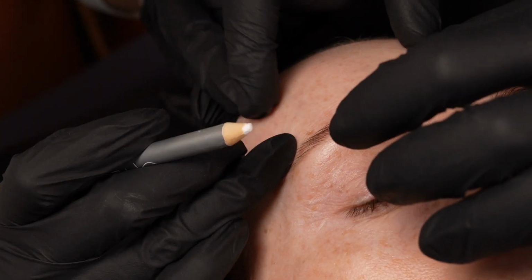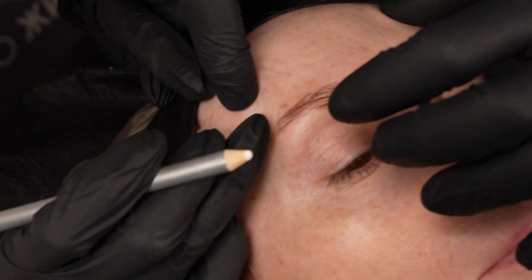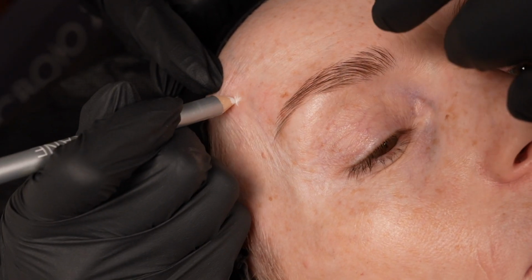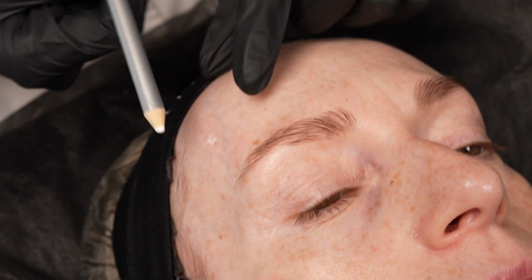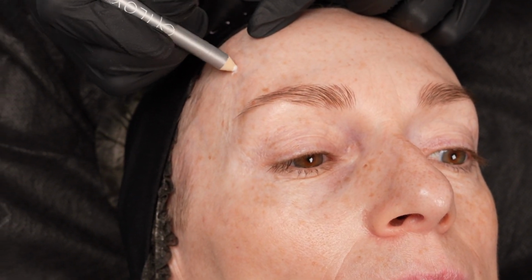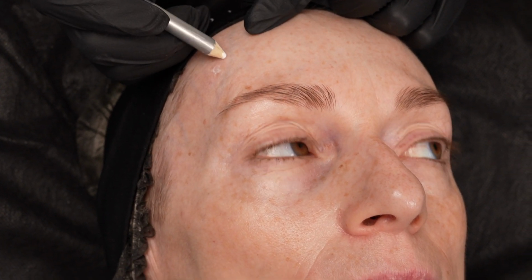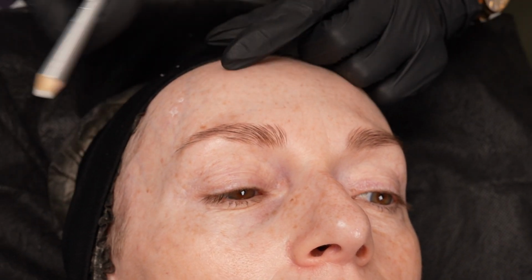Здесь прям видно венки, да, я вот примерно... Feel the crest here. Там есть гребень у нас. Exactly. Он рекомендует be careful с гребнем. She has a thin skin and a light skin color. You can easily see the veins. Can you see it there also? Да, примерно вот в этой зоне я делала прокол. What happened if I touch the vein? Not the big problems. The hematoma, yeah, and the bruising is not a big problem.